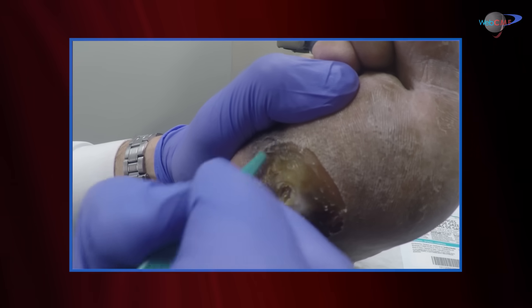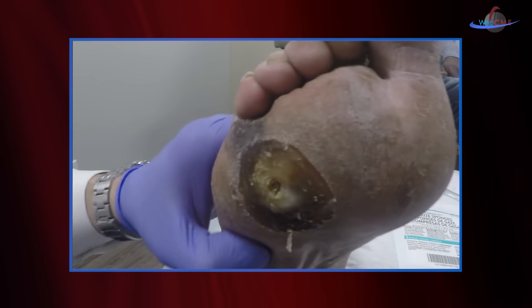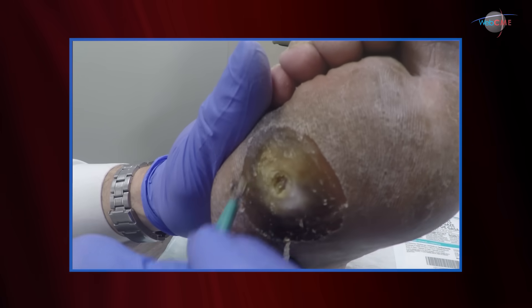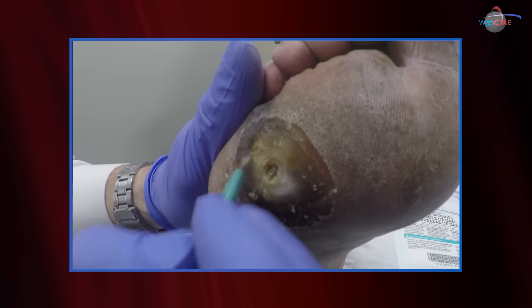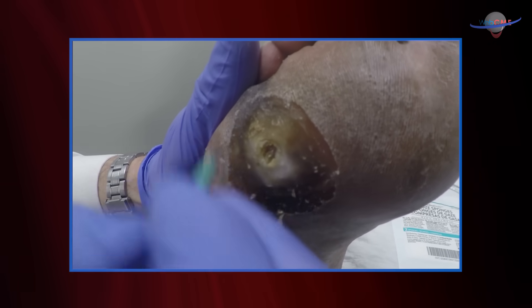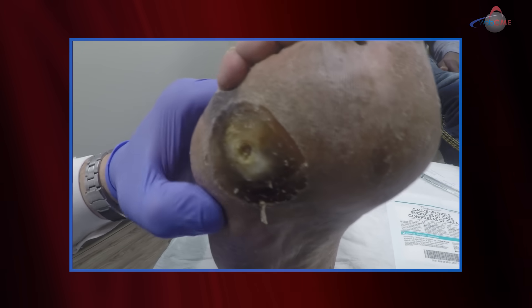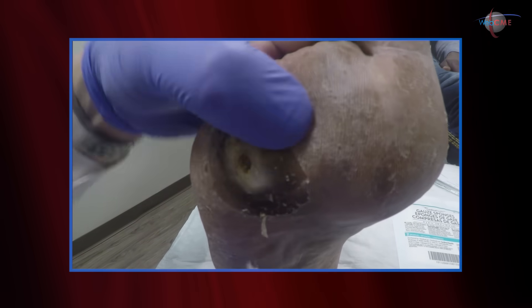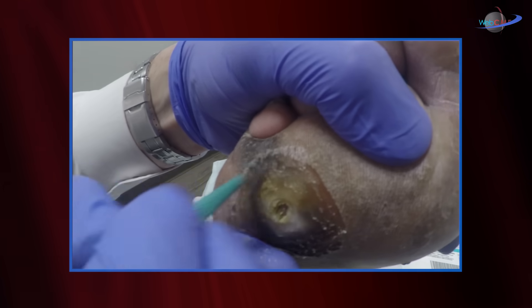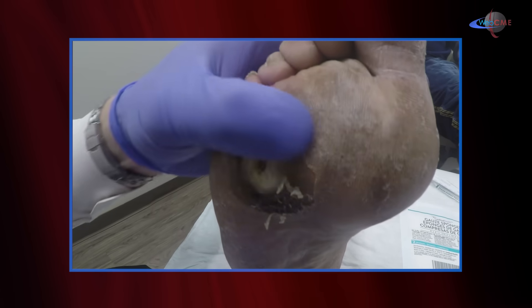What I like to do is evaluate the callus with my thumb and compare that to the normal tissue. If the callus area feels just like the normal tissue, you've done enough and you can stop. Right now this area here feels pretty much like the normal tissue, so I'm good here. Obviously there are other areas that are still pretty firm, so we're going to do some more work up in this region.